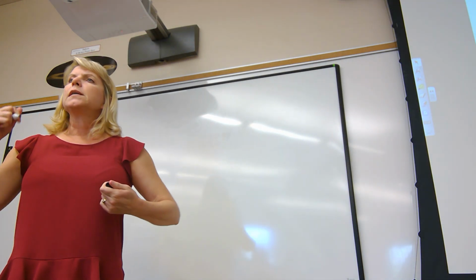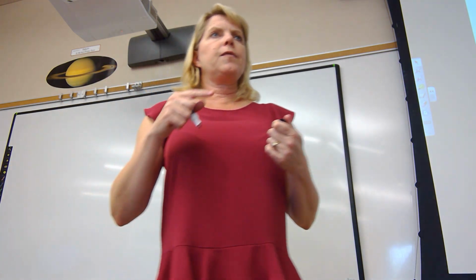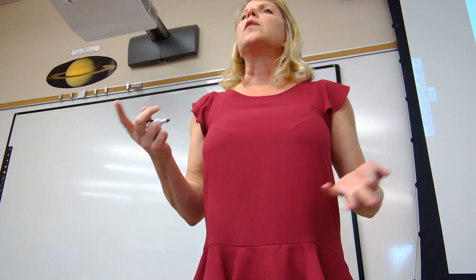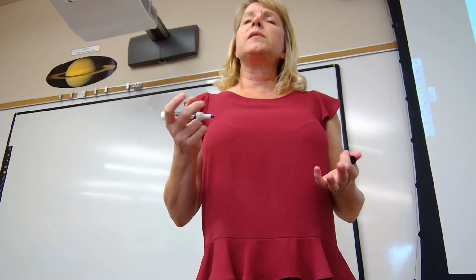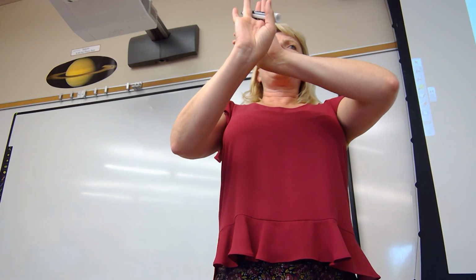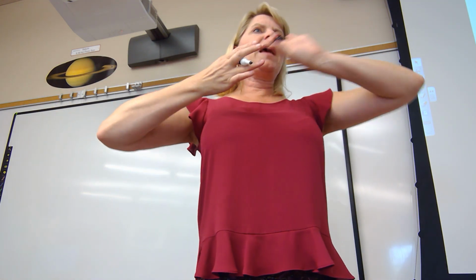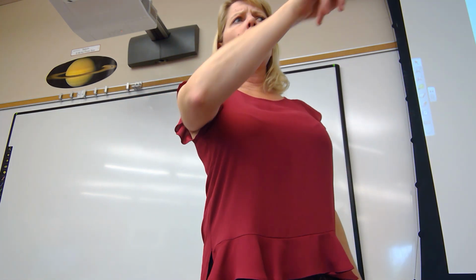Lead 1, lead 2, lead 3, AVR, AVF, AVL. All right, okay. So could you draw them on a piece of paper? And remember that if you were drawing them on a piece of paper, it's the patient's right, the patient's left, not your right, not your left.